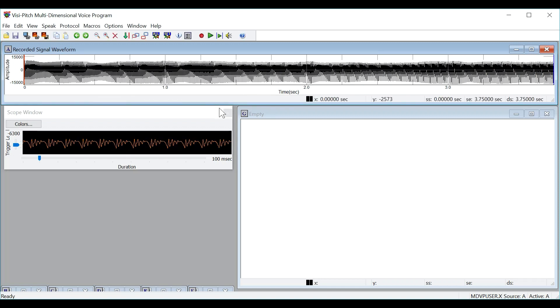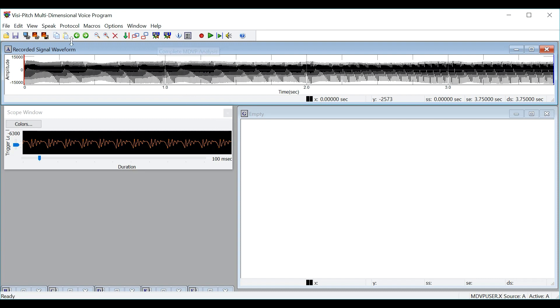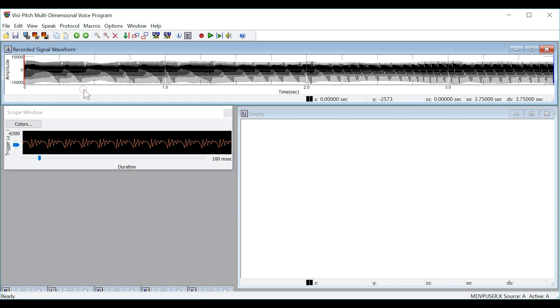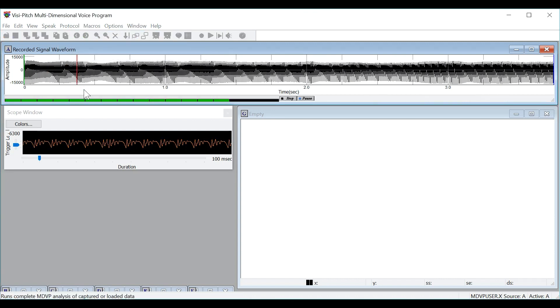Once you are happy with the signal you have recorded, you can complete the MDVP analysis. You can do that either in the toolbar here, in the protocols menu here, or simply by pressing the F7 key.